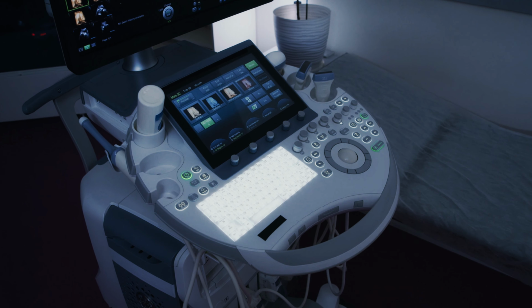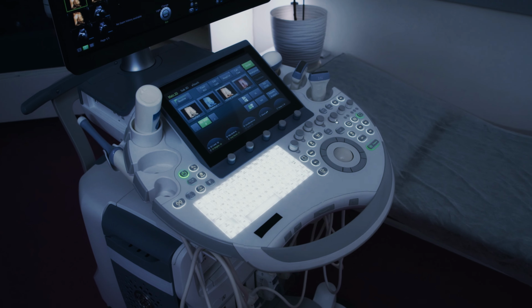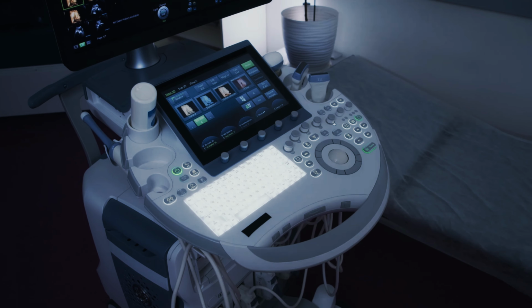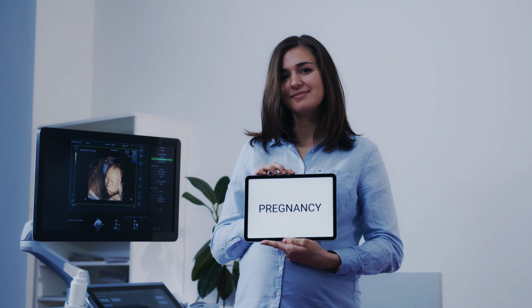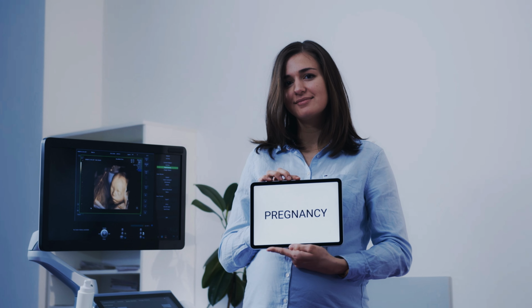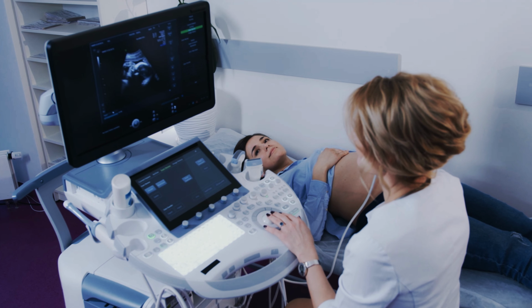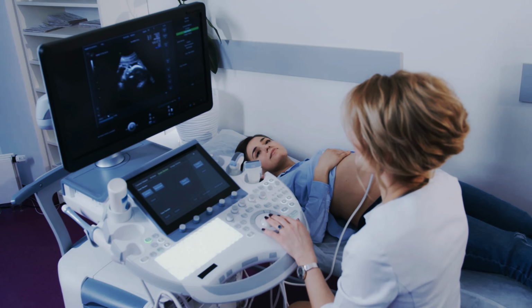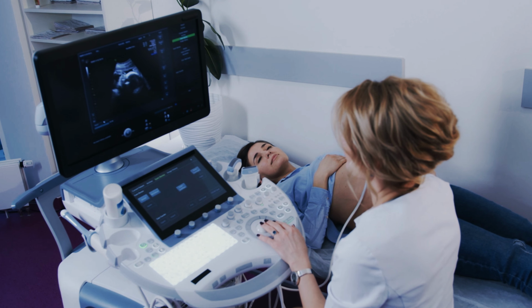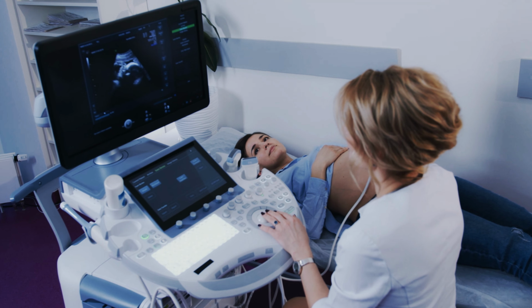How an ultrasound machine works. Transmission of sound waves. The transducer emits high-frequency sound waves, typically between 2 to 18 MHz, into the body. These sound waves travel through the body and are reflected back when they hit different types of tissue, organs, or fluid-filled areas. Echo reception. The transducer then receives the echoes reflected back from the tissues. The time it takes for the echoes to return and the strength of the echoes are used to create an image of the internal structure.